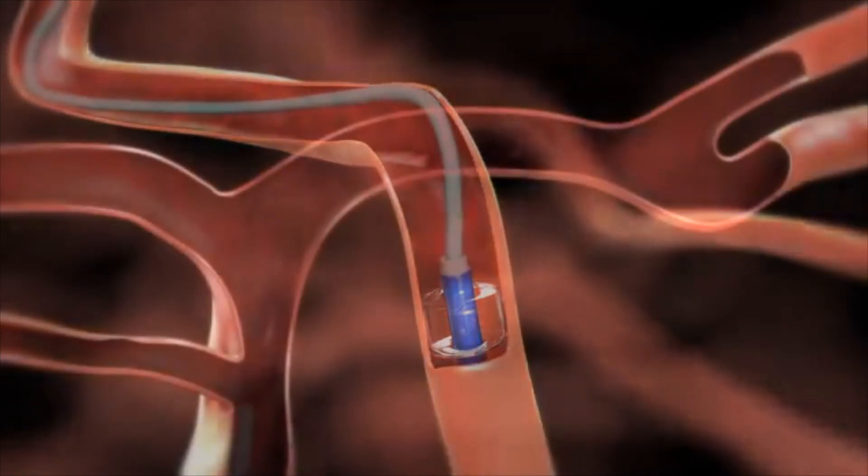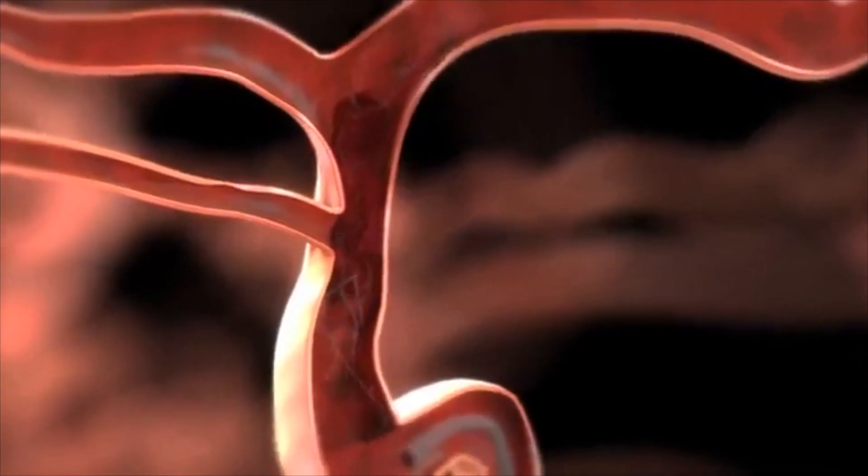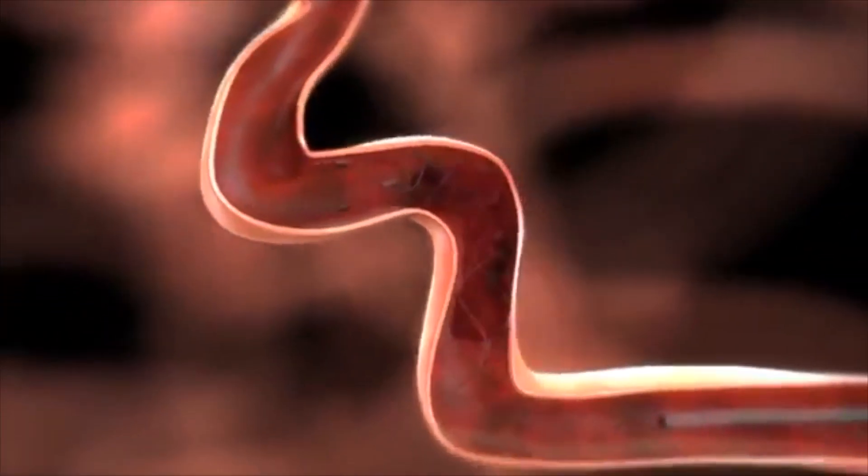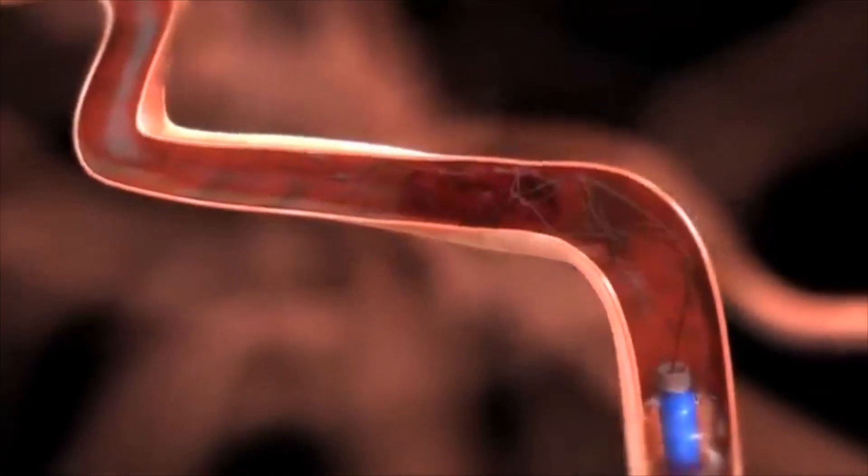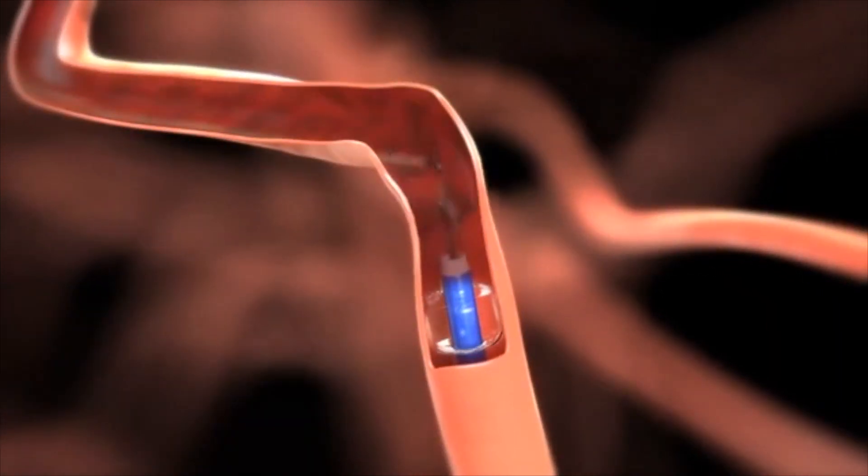To retrieve the thrombus, slowly withdraw the micro catheter and solitaire FR as a unit to the guide catheter tip while applying aspiration to the guide catheter.